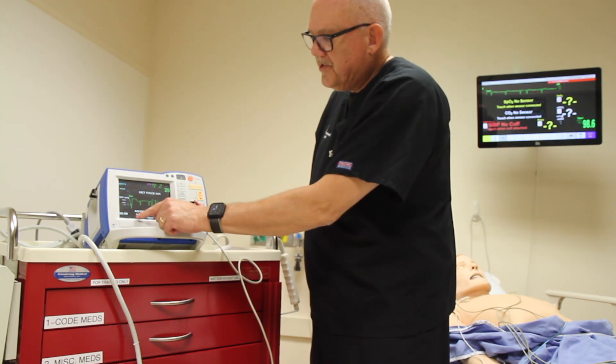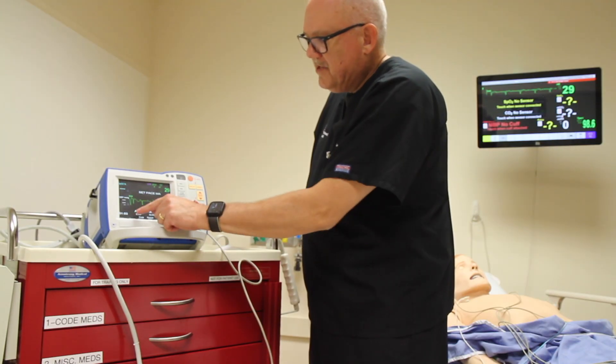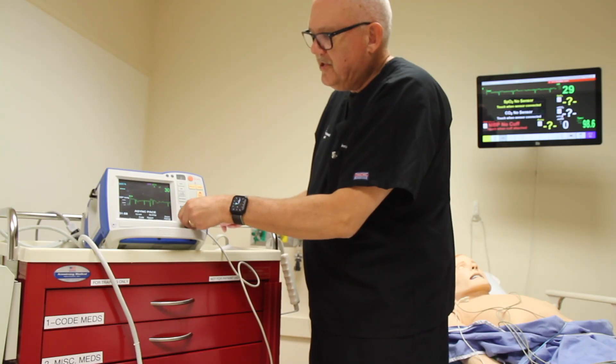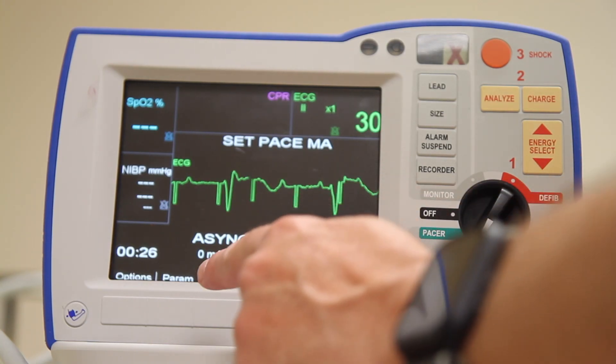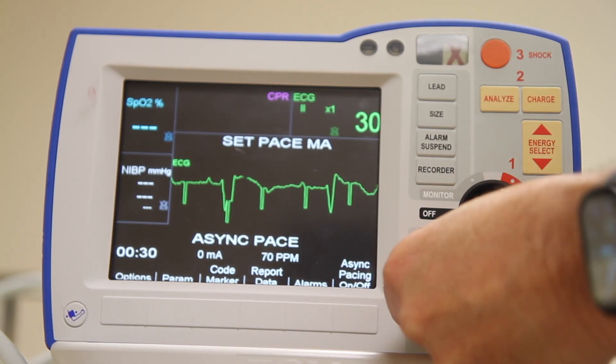The next step is to set the power output or the energy output. That's in milliampere and we have a dial here for that. Many patients achieve capture in the 60 to 70 milliampere range. You should turn this slowly at first to see how things look on the screen.